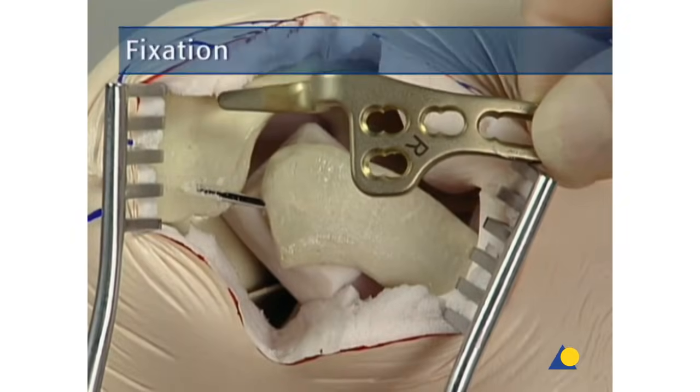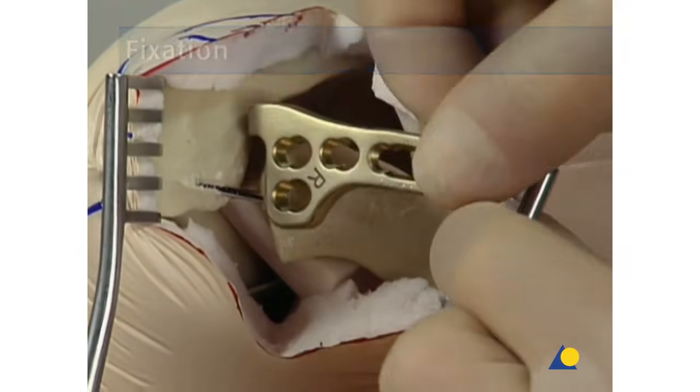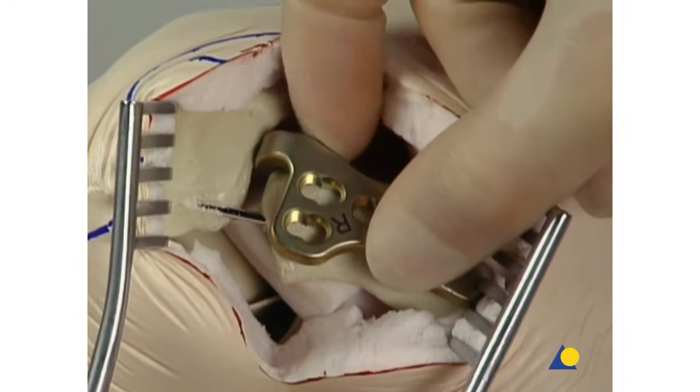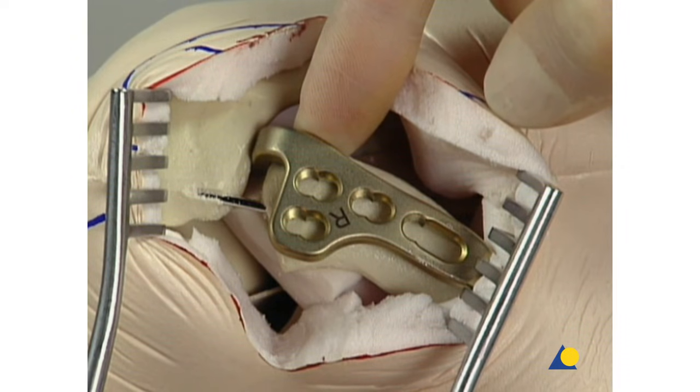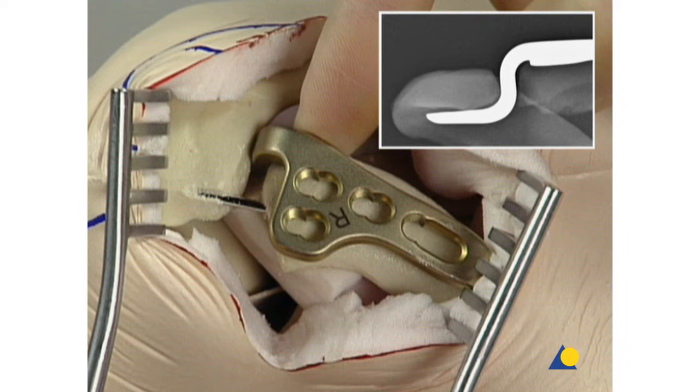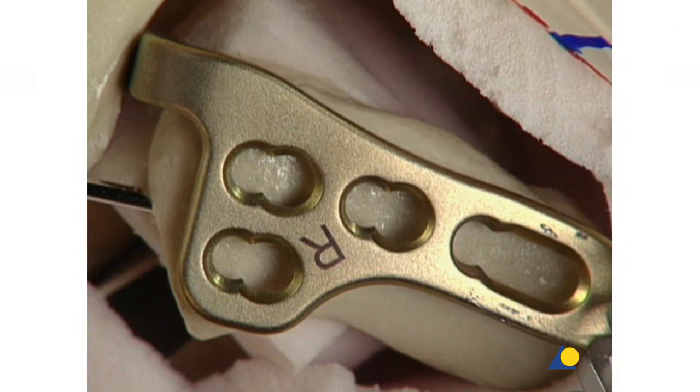The implant is placed in the position that was determined using the trial implant. If needed, the plate can be fixed temporarily with a K-wire through the drill sleeve in the distal hole to fix the distal part of the plate. Temporary fixation can also be done by introducing a cortical screw in the most medial plate hole or by securing the plate with a clamp. The correct position of the hook relative to the undersurface of the acromion is verified. It is hardly ever necessary to bend the hook. After the correct plate position is confirmed with the image intensifier, definitive fixation with screws is begun. It should be noted that titanium and steel implants and screws should not be mixed.